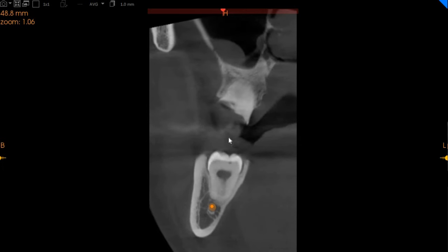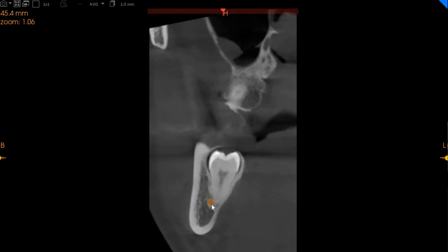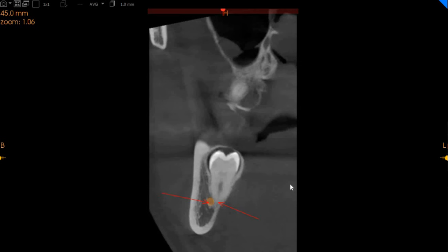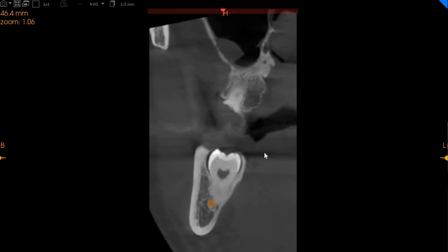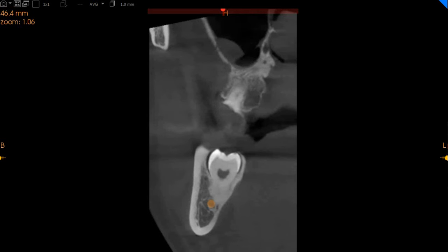The bottom right wisdom tooth is very closely associated with the inferior alveolar nerve. The tooth is positioned lingual to the nerve and it is also compressing the nerve at one point. Here you can very clearly see this is the apex of the wisdom tooth and this is the inferior alveolar nerve. This is a vertical impaction, almost completely embedded in the bone. It is not enveloping around the inferior alveolar nerve, but it is very closely associated and hence can cause damage at the time of extraction.